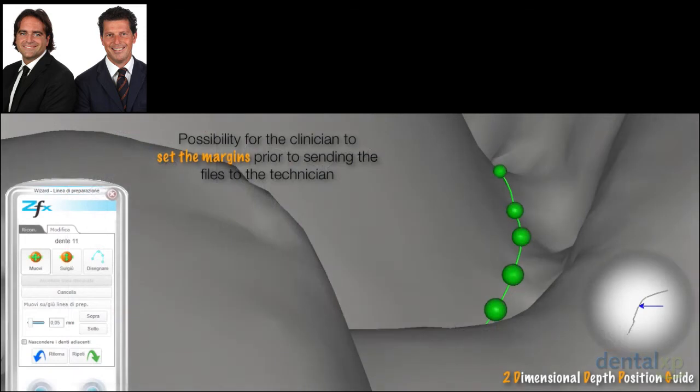And in our opinion, what is really an advantage of this system is that it gives the clinician the possibility to set the margin prior to sending the files to the technician. And we're going to see it again in a video how this two-dimensional depth position guide helps us exactly determine the finishing line that the clinician wants.